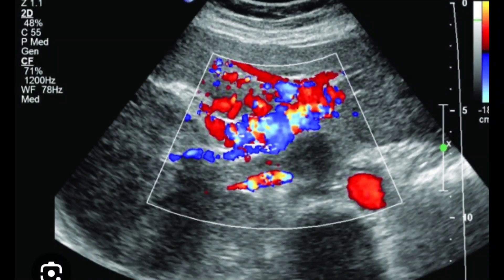This slide shows recanalization and portosystemic collateral development — in other words, dilated splenic vein and collateral development. You can write on your report that the vasculature shows increased vascularity on Doppler signals. The spleen is enlarged, the splenic vein is enlarged, and collateral development can be picked on grayscale and Doppler. On grayscale you will appreciate multiple tortuous dilated structures at the level of the splenic hilum; on Doppler, these structures fill with blood confirming collateral development due to portal venous hypertension.